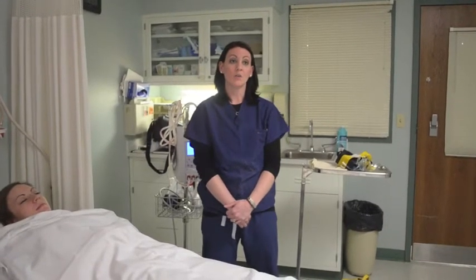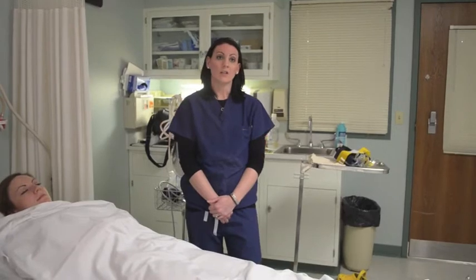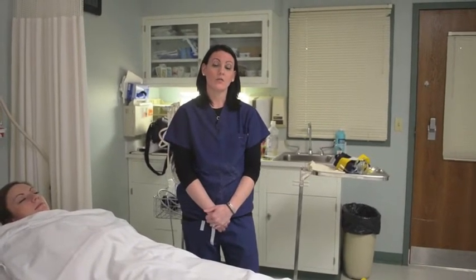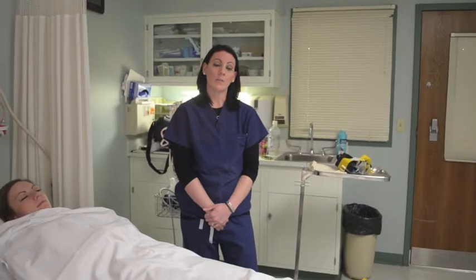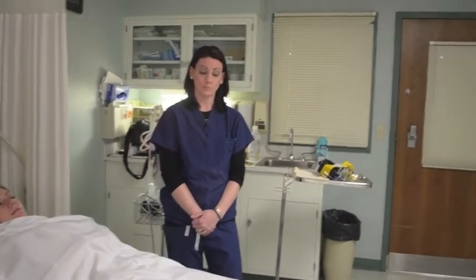Now let's discuss when a pneumatic tourniquet is clinically indicated. Two major classifications require the use of a pneumatic tourniquet: orthopedic and podiatry procedures. Orthopedic procedures include total joint replacement, arthroscopies, bone grafts, amputation, and a reduction of fractures. Podiatry cases include hammer toe procedures, bunion corrections, and plantar wart removal.